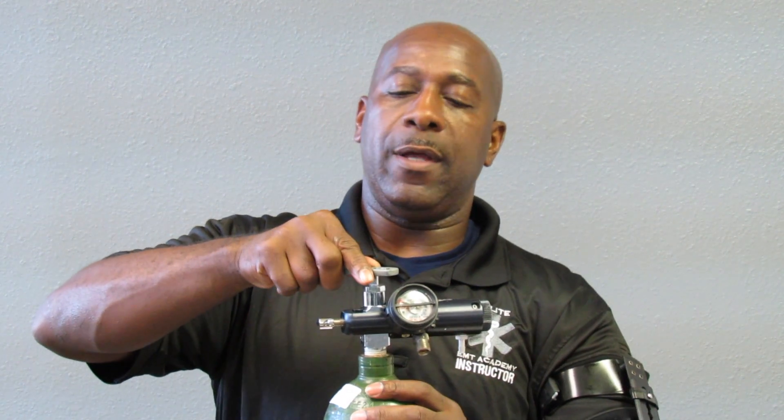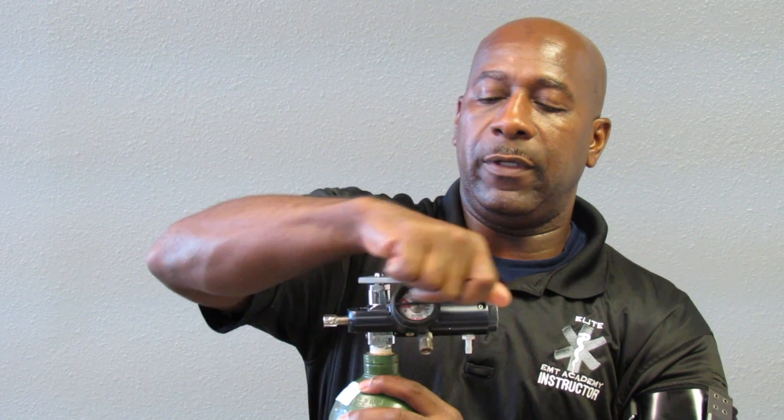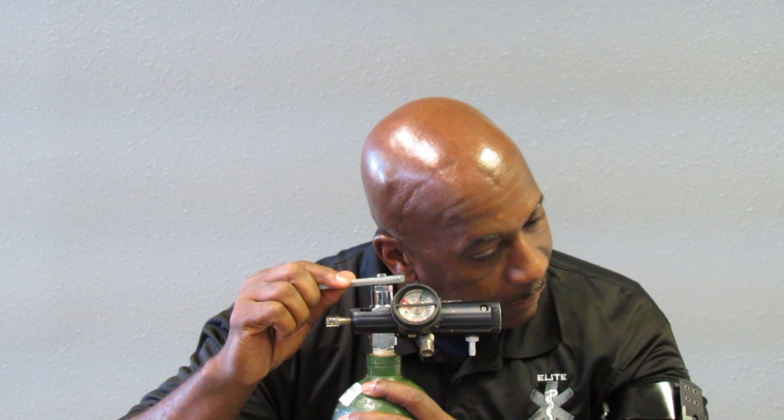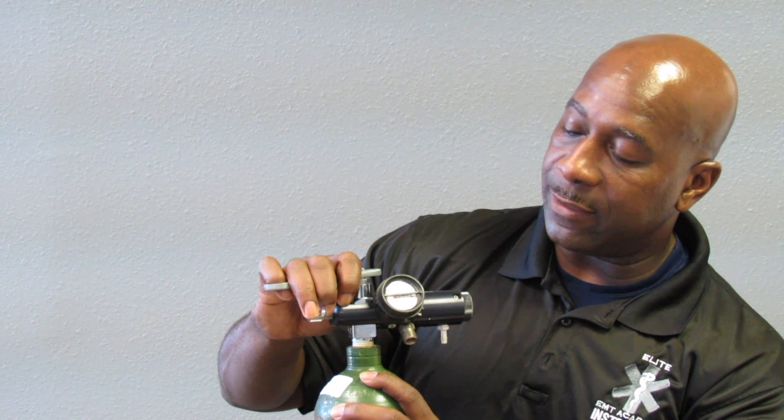Once tightened firmly, you want to open the oxygen bottle to check the PSI. Fully open the bottle, check for leaks, and listen for leaks. There are no leaks. Your oxygen bottle should register at least 1000 to 2000 PSI.